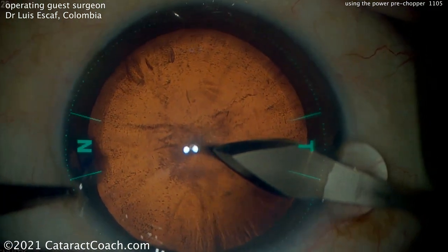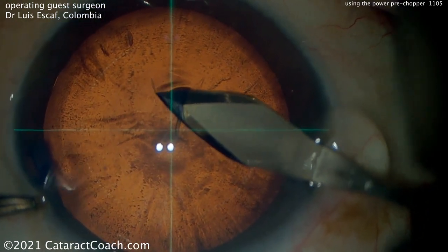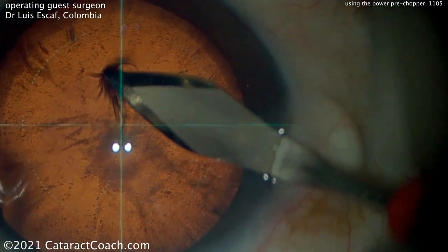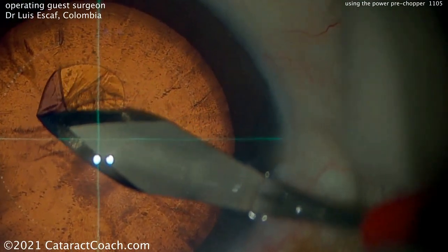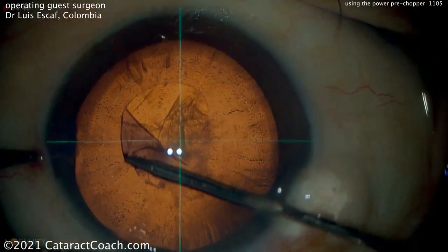Now he just uses the keratome to go ahead and cut into the anterior lens capsule and flip it up. So a novel way of doing it, and certainly an easy way, saving a step. It certainly requires some skill and some practice, but that's a beautiful result.